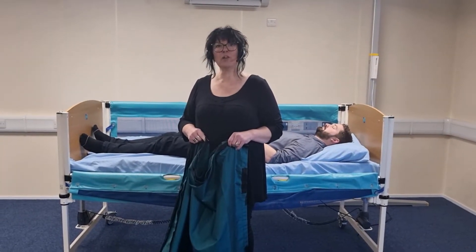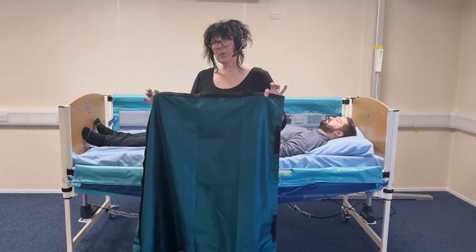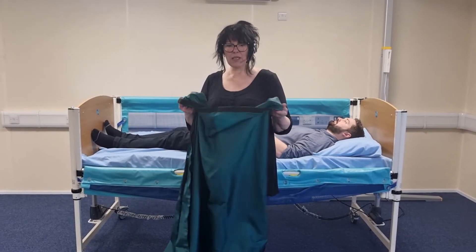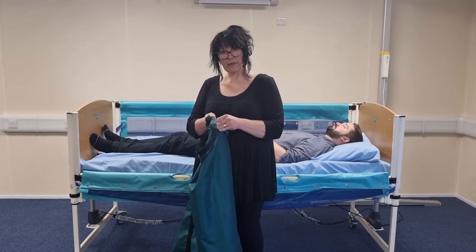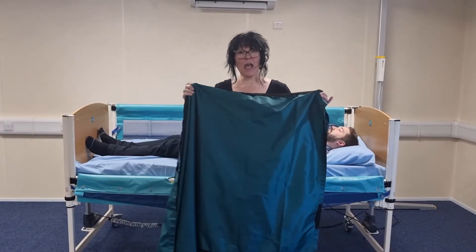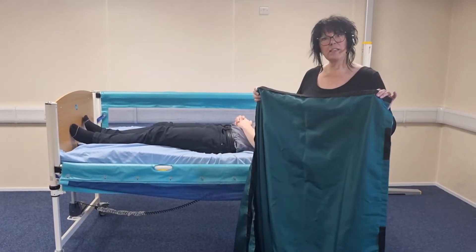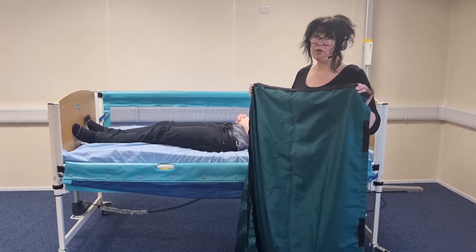This is the fitting and removal of two flat slide sheets on the bed. The principles of slide sheet use is that you need two layers of low friction fabric, because the top layer slides along the bottom layer. You also need to use slide sheets that are large enough to protect the whole of the service user's body, and this will reduce the risk of skin damage from friction or shear forces.